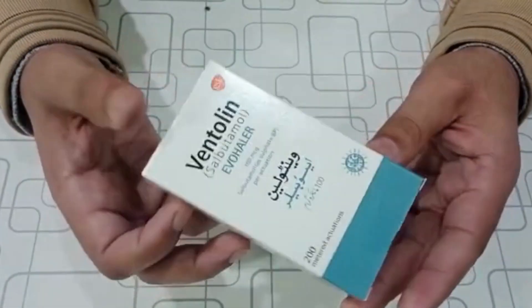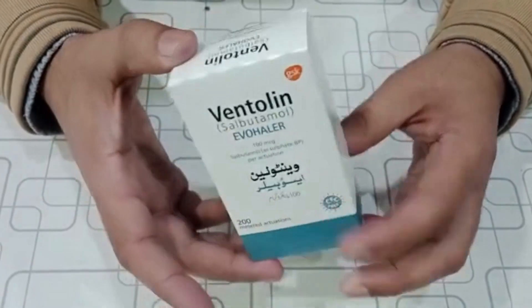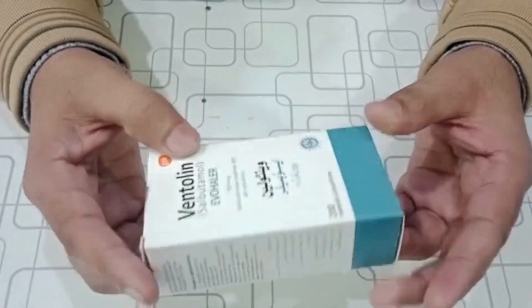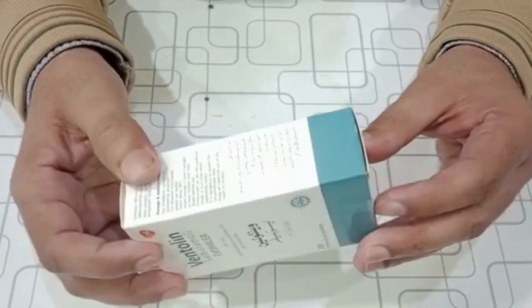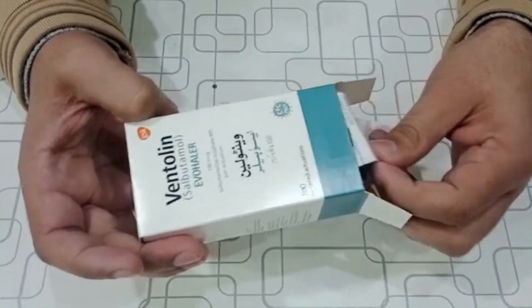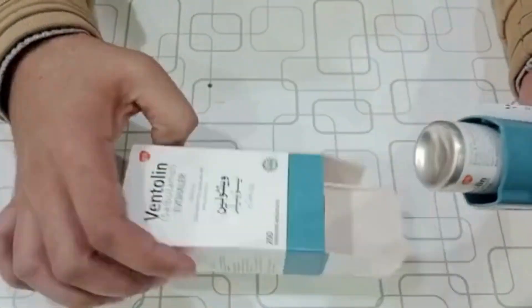Ventolin Evohaler provides short-acting 4–6 hour bronchodilation with fast onset within 5 minutes in reversible airways obstruction. It is particularly suitable for the relief and prevention of asthma symptoms, and it is indicated in adults, adolescents, and children aged 4 to 11 years.